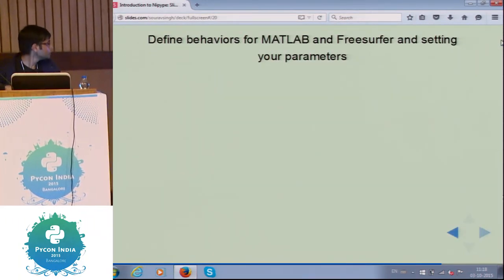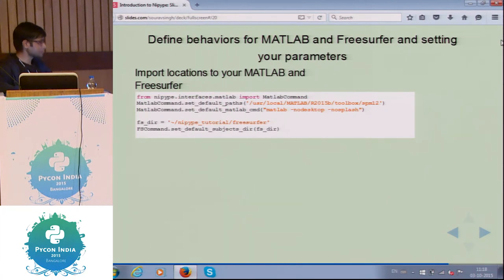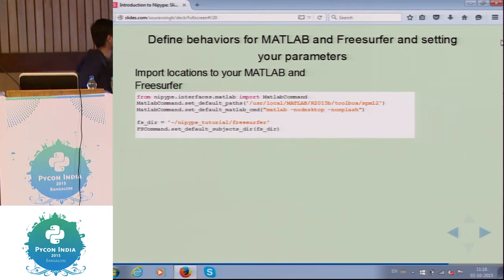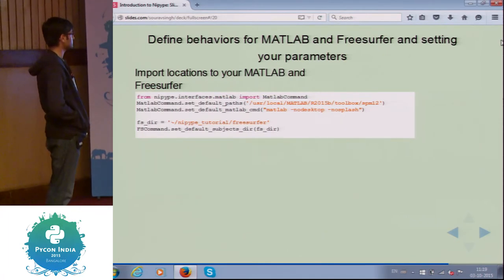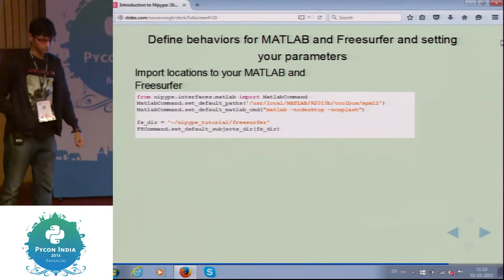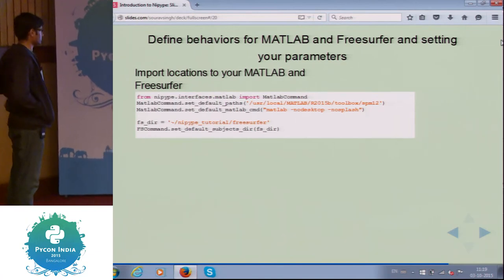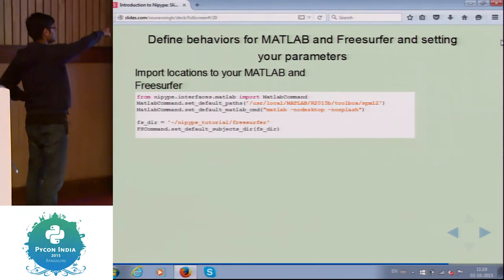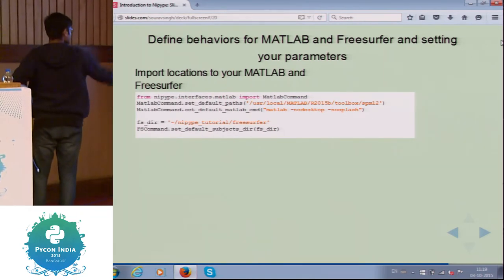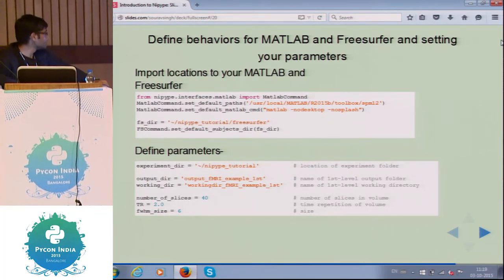Our next step is to import some statements and script locations for MATLAB and FreeSurfer. We import the necessary package which is the MATLAB command, and after that we set our default path — in this case it is spm12. Then we give the necessary options to the computer. We also have the location for our FreeSurfer program — in this case it is slash nipype_tutorial slash freesurfer — and we set that to our default FreeSurfer command function.